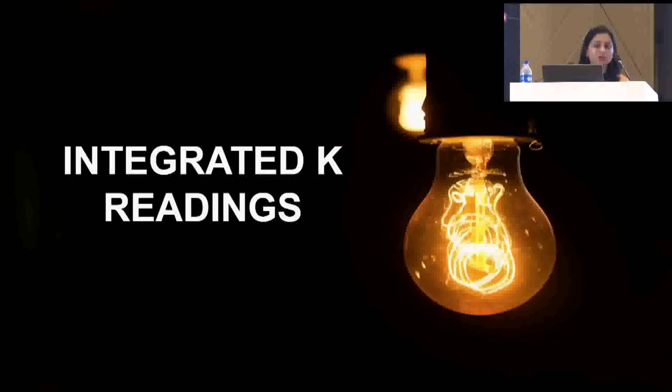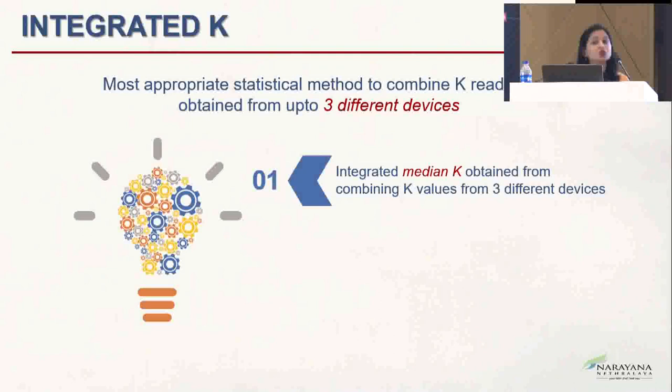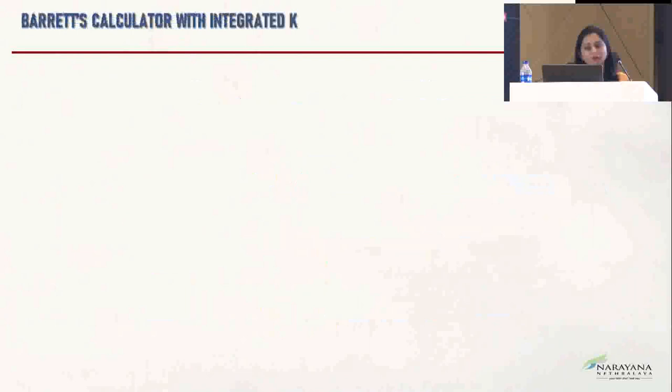There's another interesting thing, that is the integrated K reading. Dr. Barrett came up with this, where you take measurements from three different machines, so two biometers and one topographer. When the K value is taken from three different machines, we call it the median K. Suppose you do not have three machines, you have just two machines, and you take readings from just the two, then you call it the mean K reading, but still the median would be better. So you take from the IOLMaster, LenStar, and the Pentacam. This has proven to be more efficient. The residual spherical and the astigmatism power has been very good. So it's better to use the integrated K value.